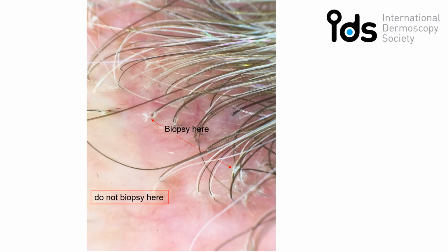Usually start your exam of the scalp with dry trichoscopy so you can visualize the casts. If you use immediately the interface solution like alcohol gel, you hydrate the scalp and you may miss them. Also, when you take the biopsy, always aim for the areas with the affected hairs. We talk about the dermoscopy-guided biopsy.